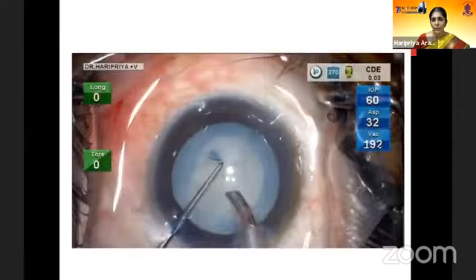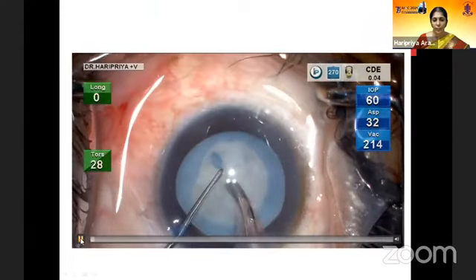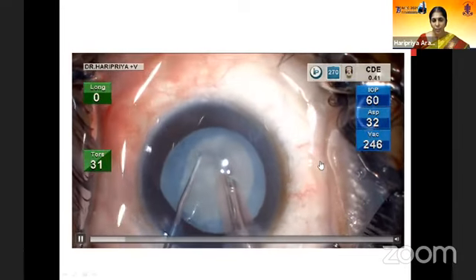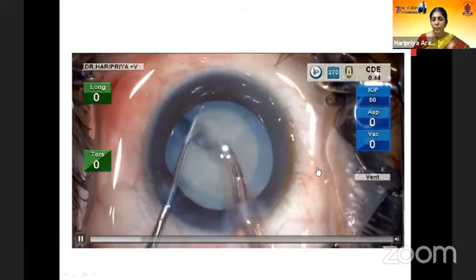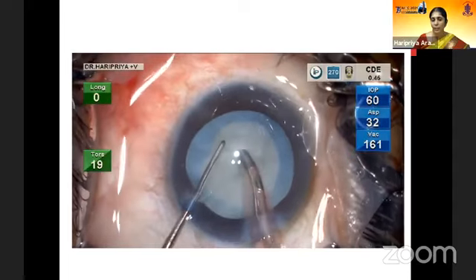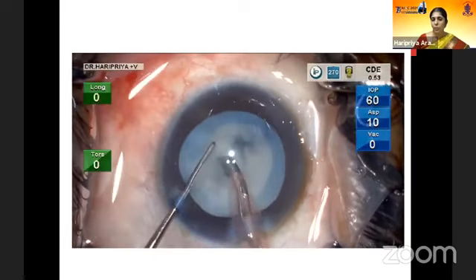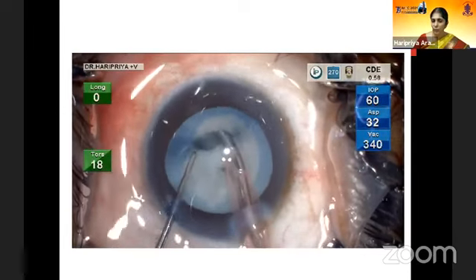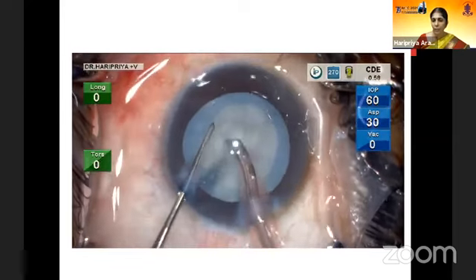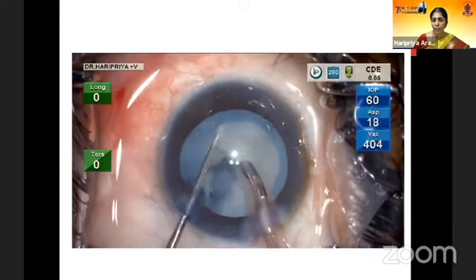So this is a case which is being done with the Centurion system without the Active Sentry. If you note, my target intraocular pressure here is 60. This active fluidics permits the surgeon to have a target IOP, and the machine strives to have the IOP around that setting. This is the big step forward from the gravity fluidics, because we saw better patient comfort during the phaco procedure and chamber stability as well. We also today have an advantage of having higher settings when we're using this technology.